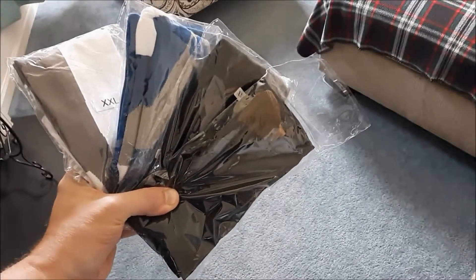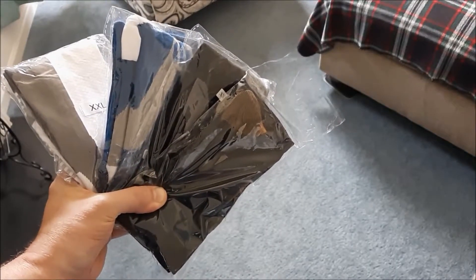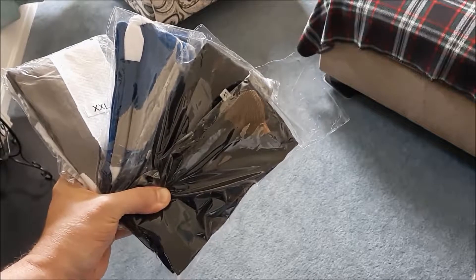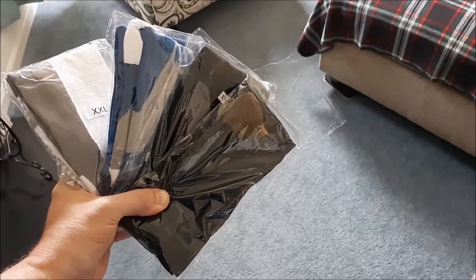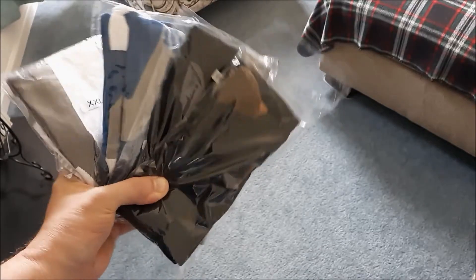These are compression socks. I've been having some problems with circulation and nerve issues and varicose veins in my legs, and I've been having a lot of nerve pain and just discomfort in general, so I thought I'd try these out.